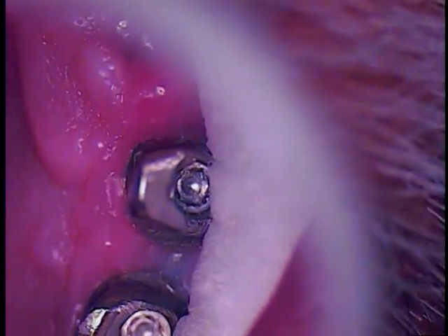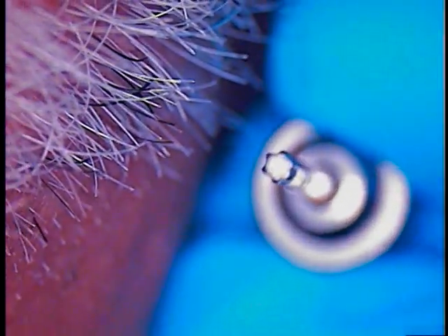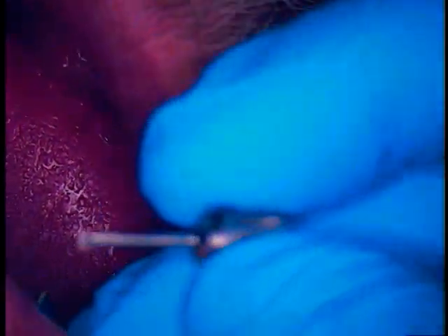We're going to make an attempt to try to unscrew that by hand. We have special instruments — we know the diameter head of that screw. This is just a basic star wrench, and you can see the star configuration. It has rounded corners. If we seat this with some pressure, we might be able to get this screw undone.